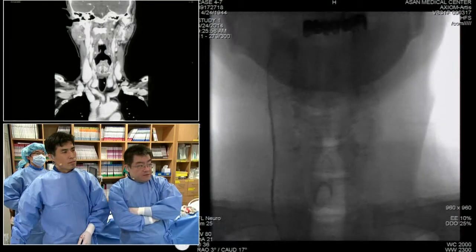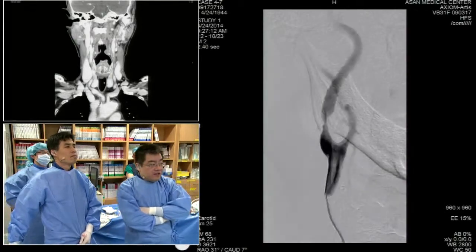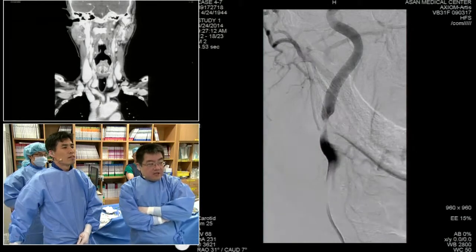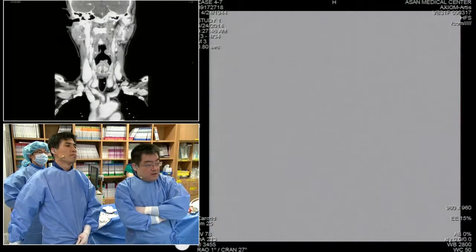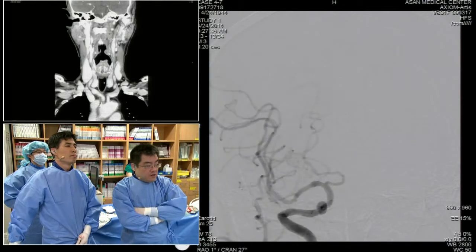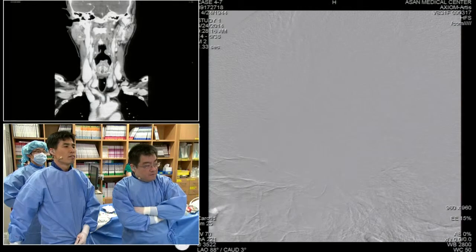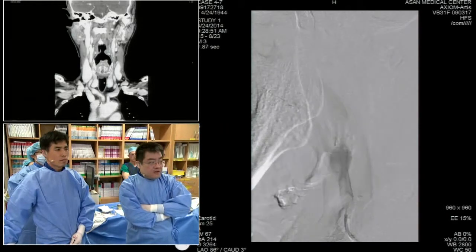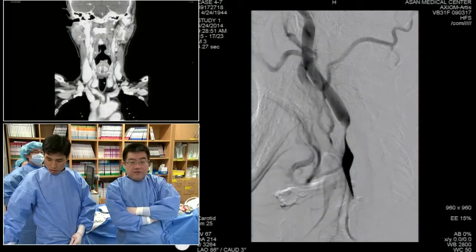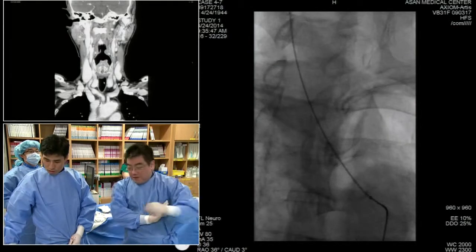Okay. Next. So a selective carotid injection can tell us how tight the stenosis actually is. Next one. Intracranial vessels are okay, but A2 cannot be seen. This is a lateral projection. Next one. And this is a lateral visualization of the lesion. So, no, let's stop here.